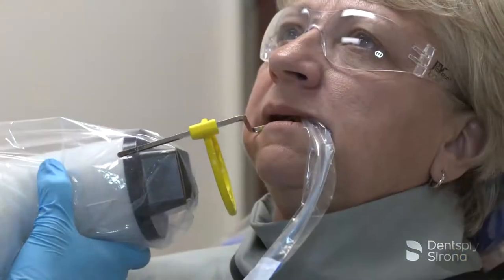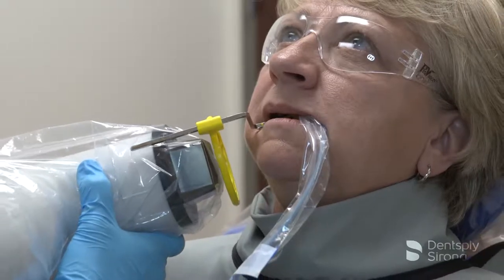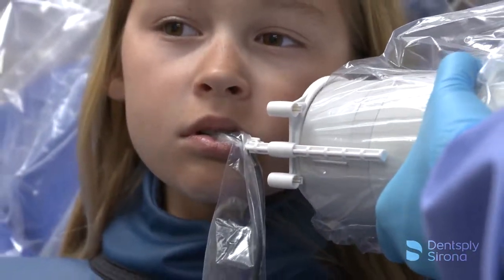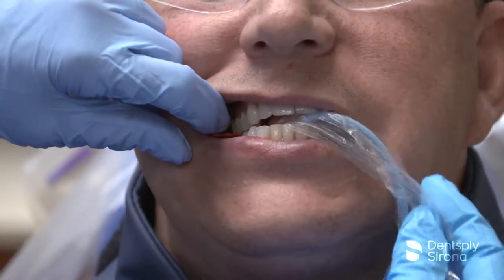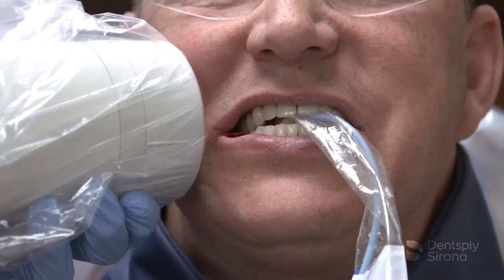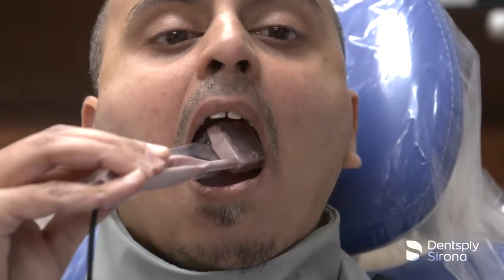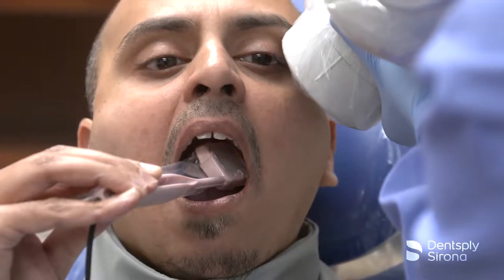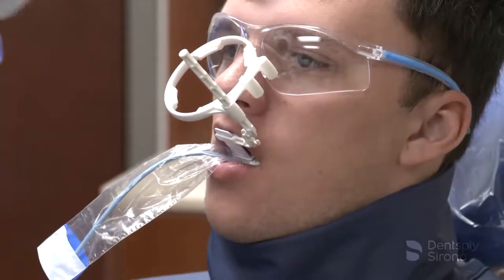Dental radiographic exams are one of the primary diagnostic tools to determine disease states and to formulate the appropriate treatment. Radiographs should be prescribed according to selection criteria guidelines. These guidelines are based on a variety of factors including patient's medical and dental history, clinical signs and symptoms of disease, risk factors, age and dentition, and new or recall status.